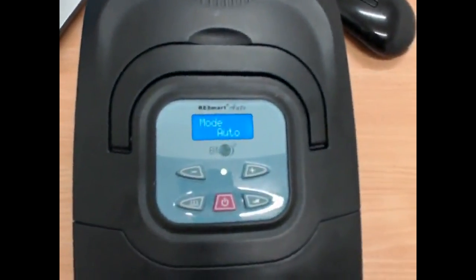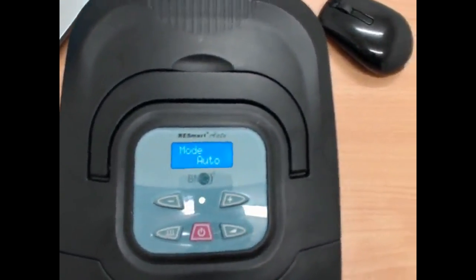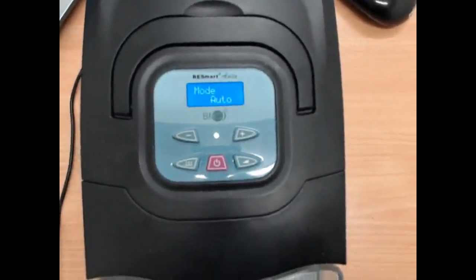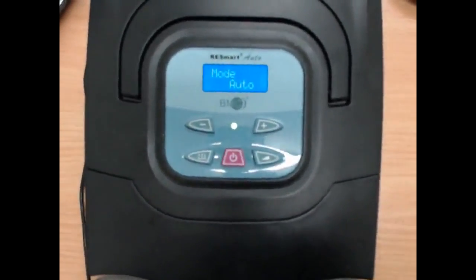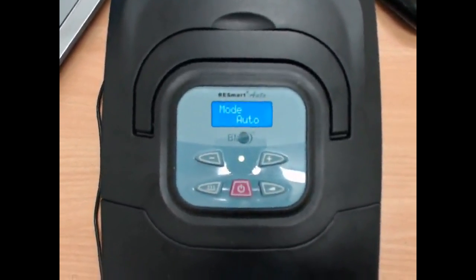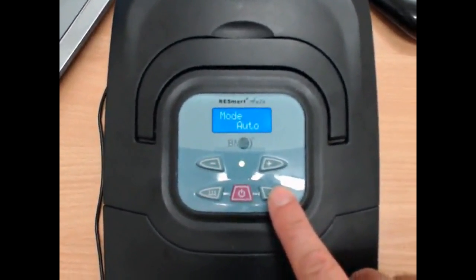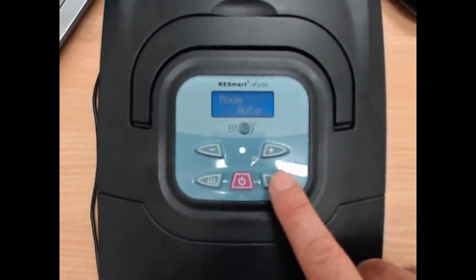Okay, once you've done that, it'll come up and it'll say the first thing, which is the mode. Mode is basically the way that the machine is going to deliver the pressure. If your mode is auto, it will variably deliver the pressure, so it will automatically adjust the pressure throughout the night. If you want to change that, you can set it to fixed, which means that the machine will deliver a set pressure. So one set pressure that's continuous.